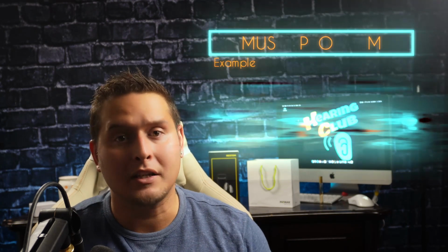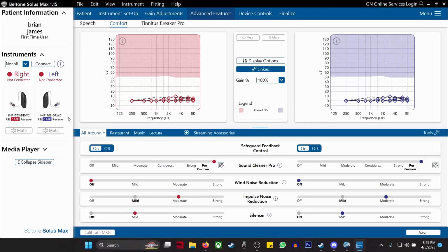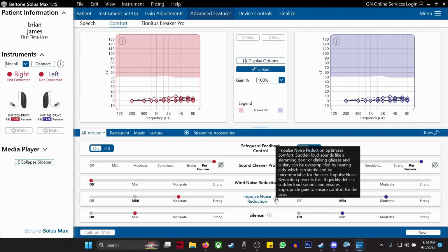Now, one more example of when you'd want to use a different mode or a different program is the music program, or the music mode. I'm going to give you an example of how these different programs are optimizing your hearing aids. In music mode, one of the options, called impulse noise reduction, gets turned off. Impulse noise reduction is an advanced feature in these hearing aids, and what it does is recognize loud, impulsive, or sudden sounds, and it does not amplify those sounds.